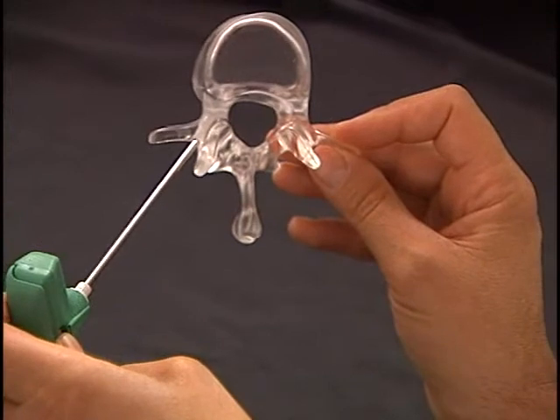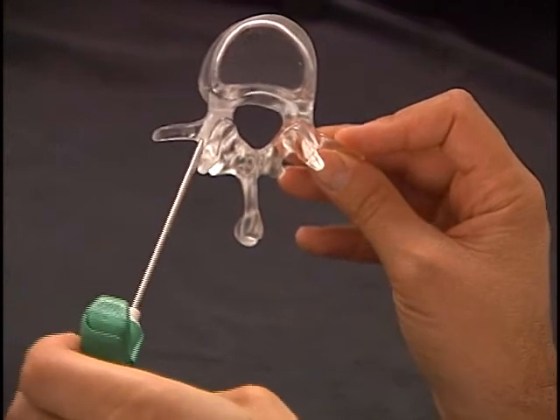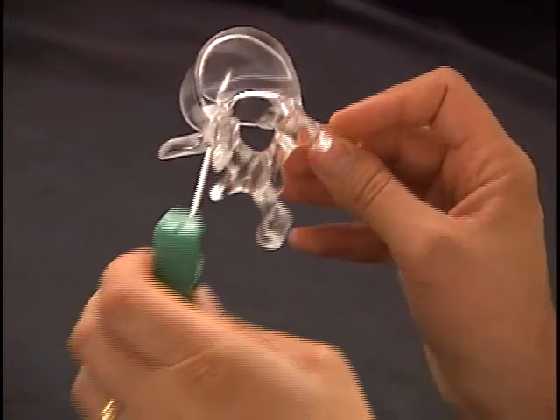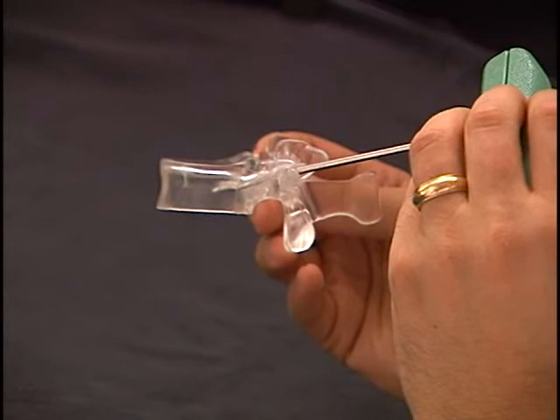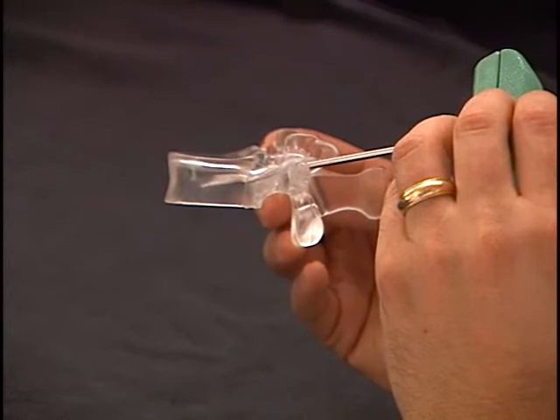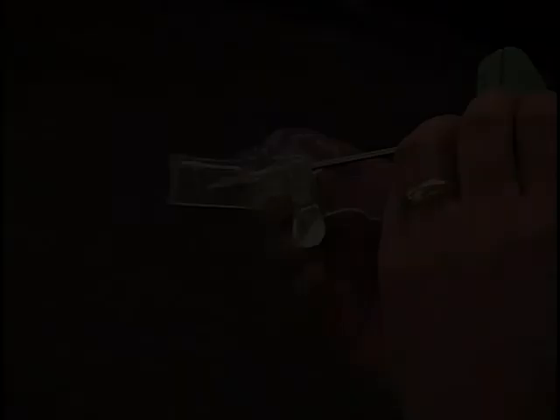If at any time the trajectory is identified to be inappropriate, the surgeon can withdraw the instrument slightly and, by deflecting the hand, redirect to a more appropriate trajectory into the vertebral body. Once gaining access into the vertebral body, it may be advanced under lateral fluoroscopic guidance to the center of the vertebral body for direct cement injection for vertebroplasty, or for exchange over a Kirschner wire for an osteointroducer cannula for kyphoplasty.